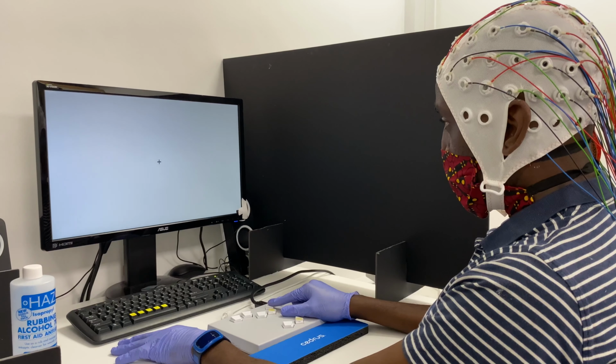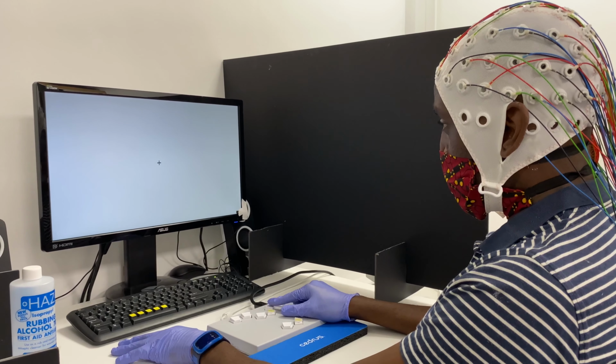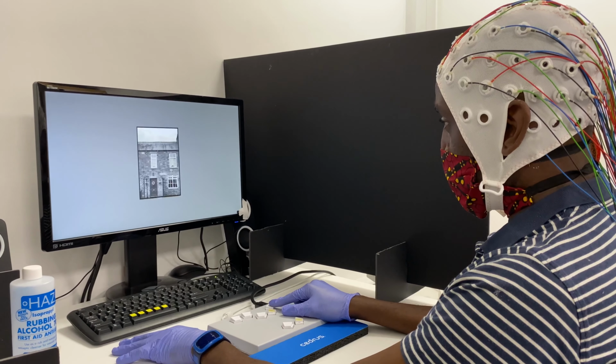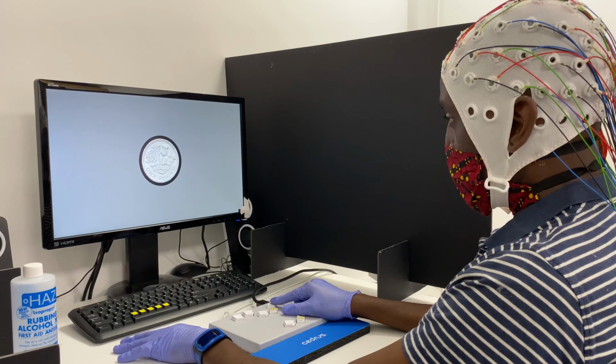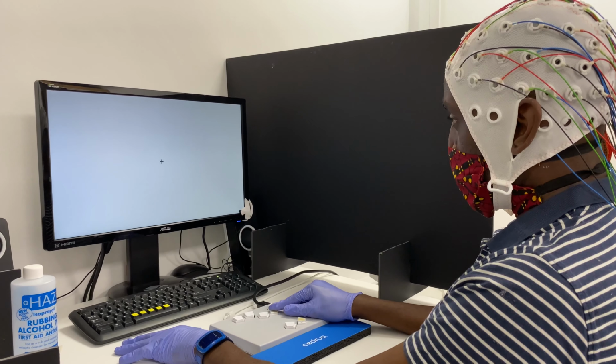As you can see, it's not that easy. You cannot group the houses by differences or because they look similar. Each time the pictures are randomly assigned to a group, so the participants really need to learn each of the images of each of the houses.